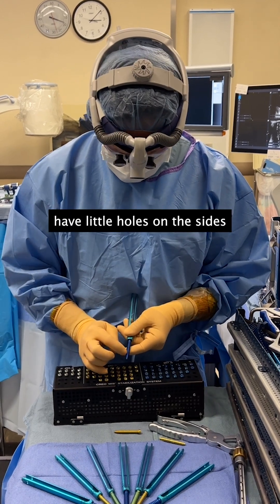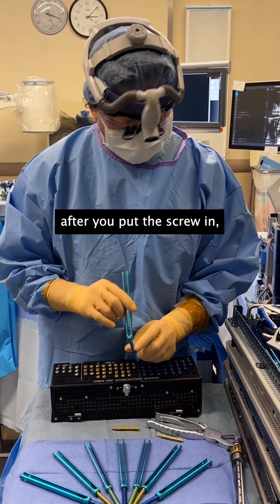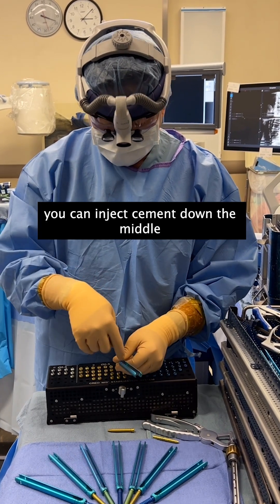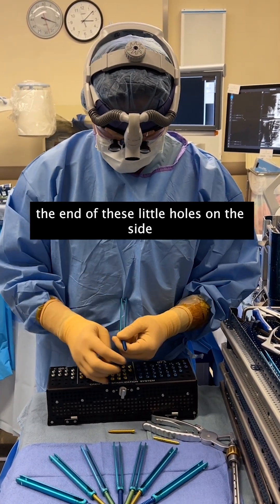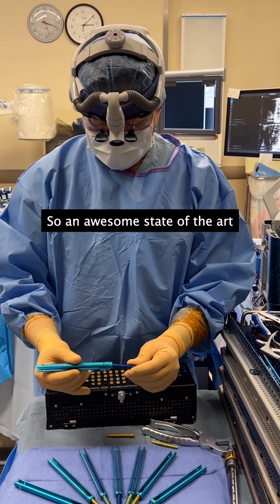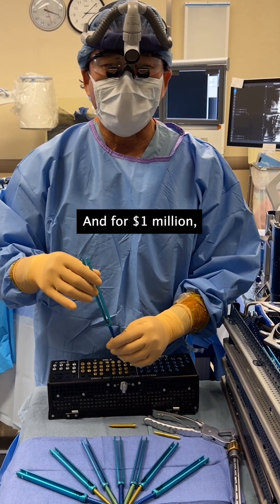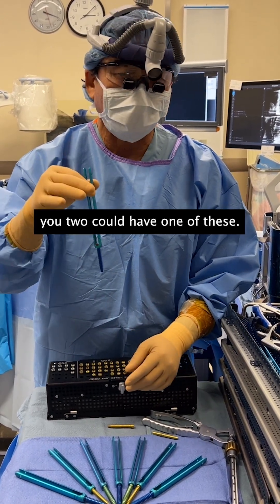Some of them even have little holes on the sides so that if you're osteoporotic, after you put the screw in, you can inject cement down the middle — it'll come out the end and these little holes on the side and will reinforce it. So an awesome, state-of-the-art, minimal-invasive pedicle screw. And for $1 million, you too could have one of these.